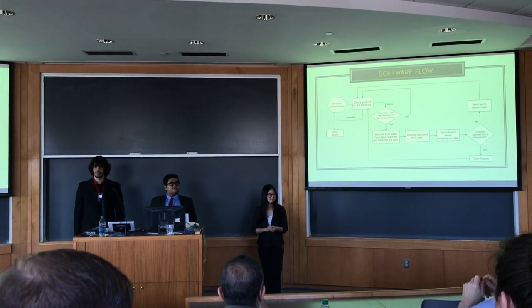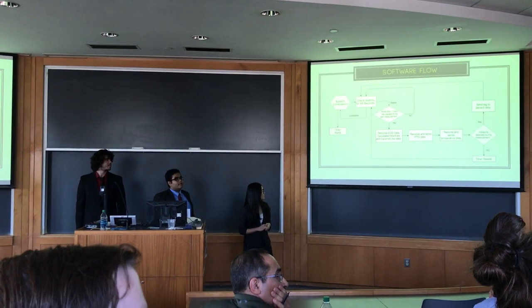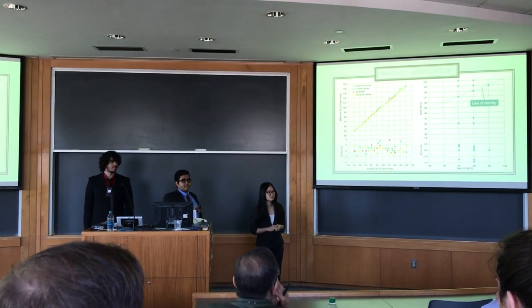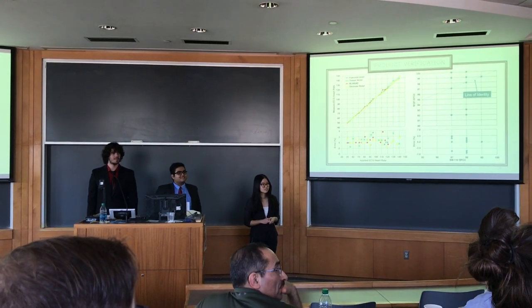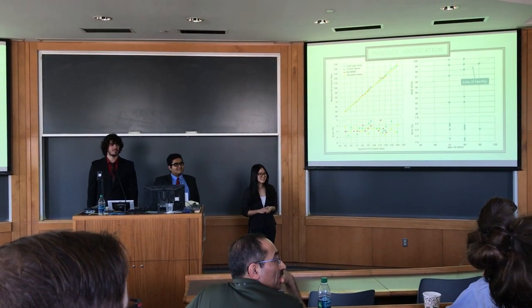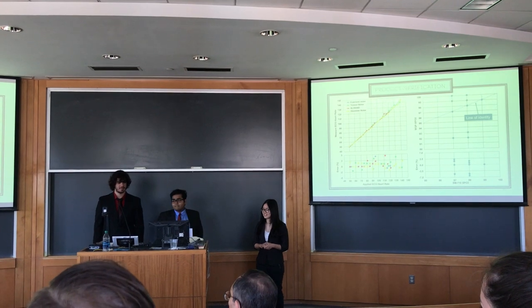Any other questions? Yes. So for the motion noise in your comparison to the pulse oximeter, was that you just standing there, or have you measured motion noise while you walk around? It was just standing there for this. I would suggest, in the past it worked perfectly lying in the bed, but then everybody was sick when they walked around because it gave false positives. Right. So you're going to have to do that. Yes, absolutely. Thank you.